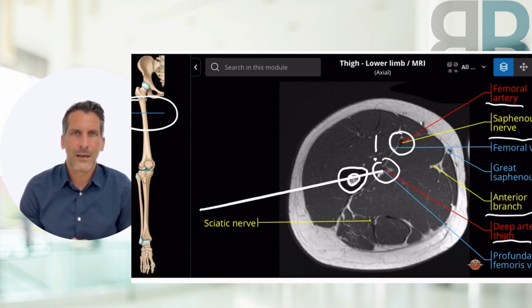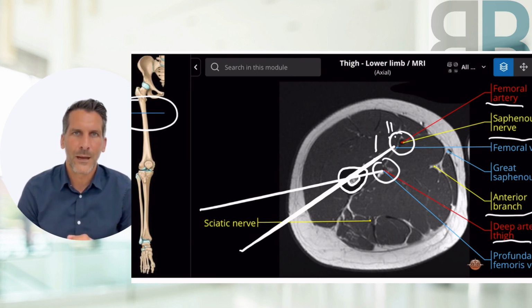Drilling into the major leg artery can be just as fatal as drilling into the major nerves. This danger is especially present when drilling with the long drill bit beyond the level of the bone, and in doing so, accidentally injuring important structures.